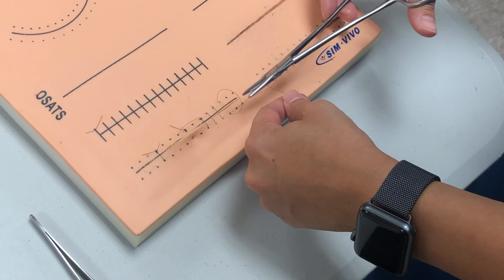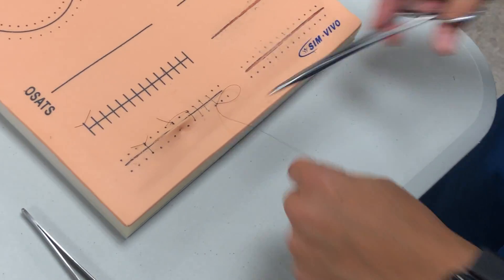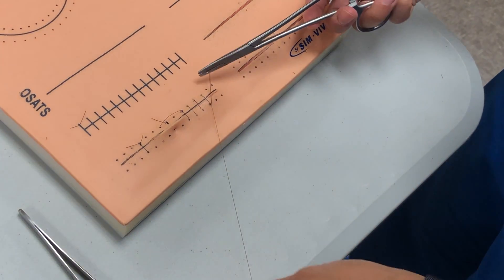And I'm going to do a surgeon's knot using this and pull it as tight as I need to, so it's not too tight, not too loose. And then I'm going to close off the knot like that and then finish tying them.